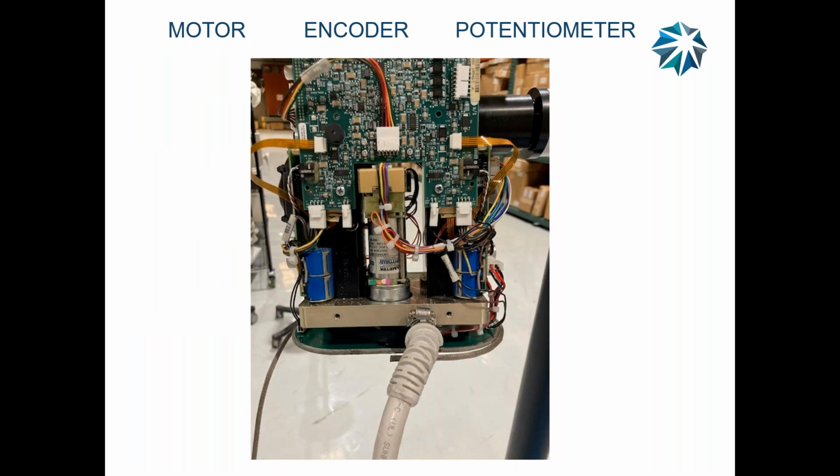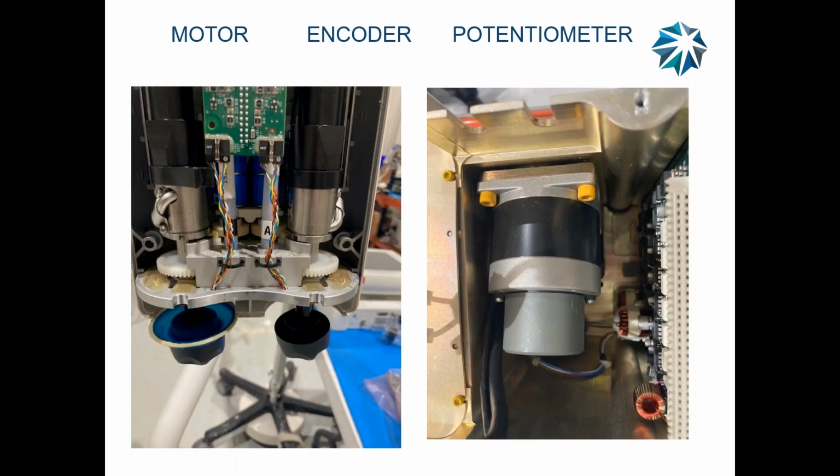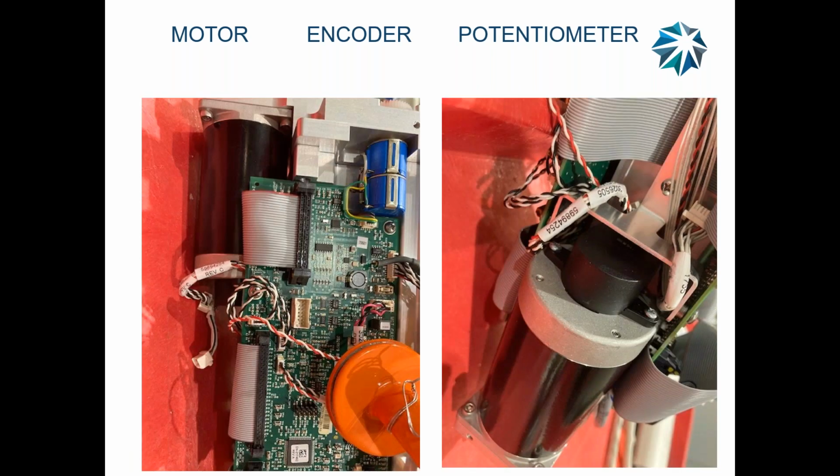Again, you see up here, potentiometer, encoder, motor. Push the right buttons here. Motor, encoder, and there's the potentiometer right there, linear. There. Solaris. Here's the potentiometer right back here. And here's the motor and the encoder down in the base. Completely separate on this one. Same thing, this is on the Mark 7, motor, encoder, and what do we got here? A blue pot. Very easy to find.